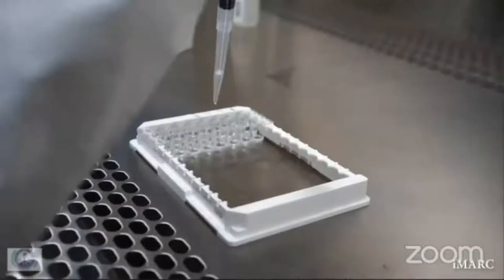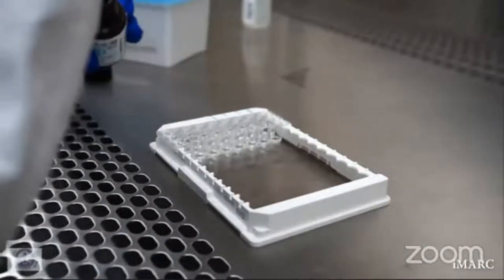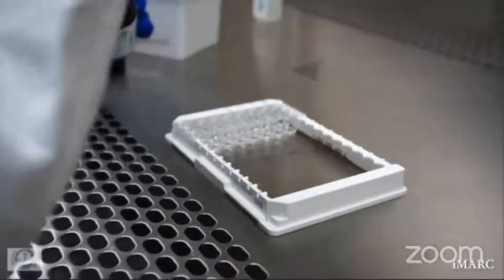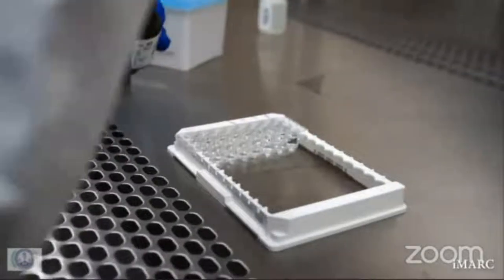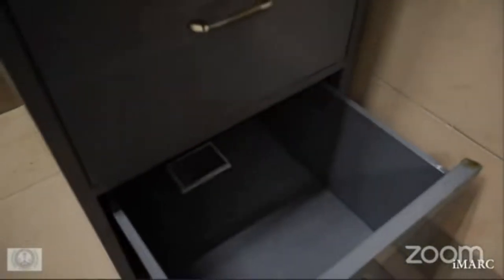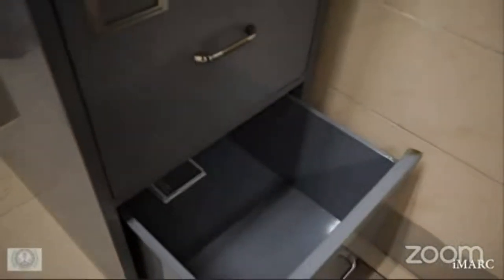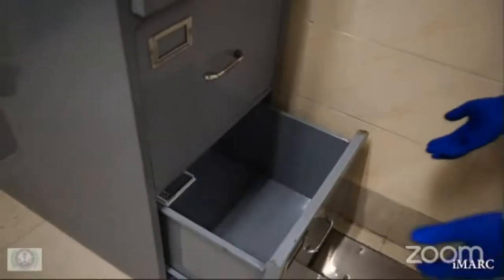After the washing step, rapidly add 200 microliters of chromogen TMB solution, which acts as a substrate, to each well and avoid exposure to bright light. Then incubate the microplate in the dark at room temperature of 25 degrees centigrade for 30 minutes, and do not use the adhesive film during the incubation step.